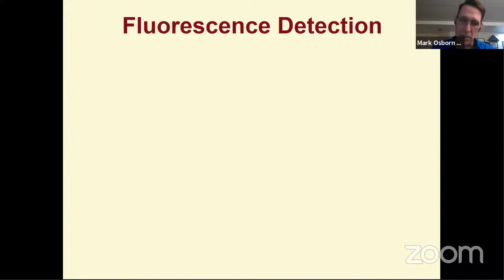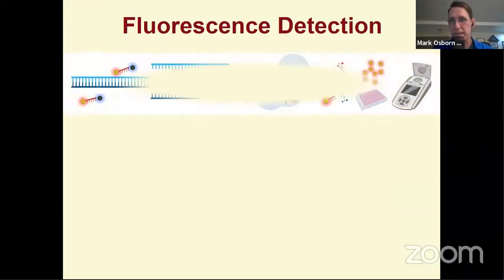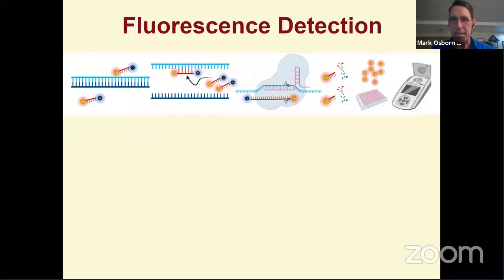We also wanted to pursue the fluorescence detection capability, again because of the sensitivity issue, but as well as scalability. It's common for many public health departments here to perform tens of thousands of tests per day. And so we wanted to ask the question, could we streamline and increase throughput of this methodology using fluorescence detection?